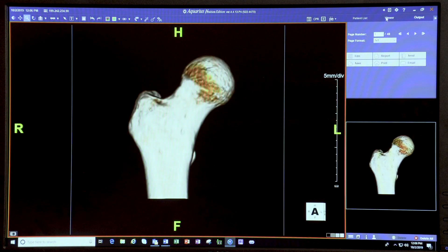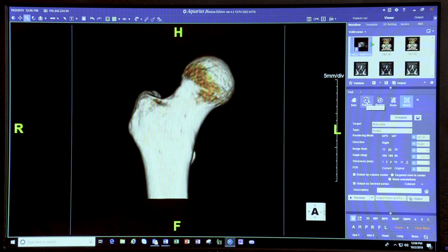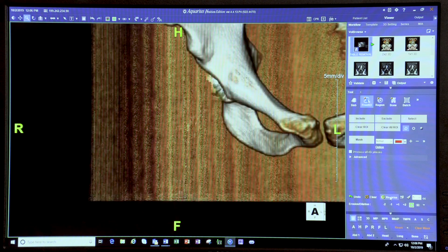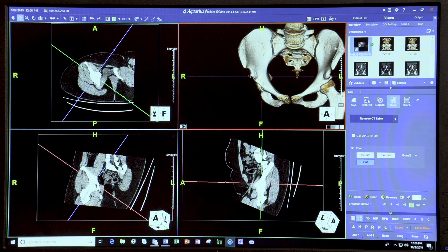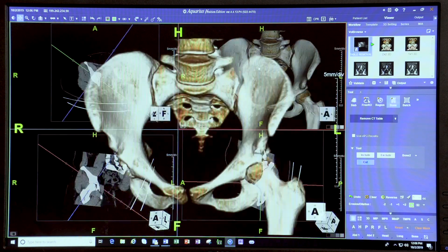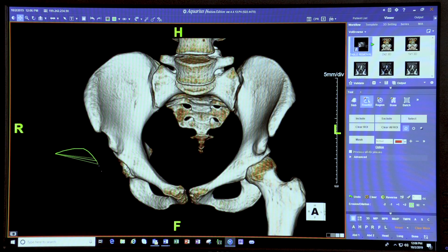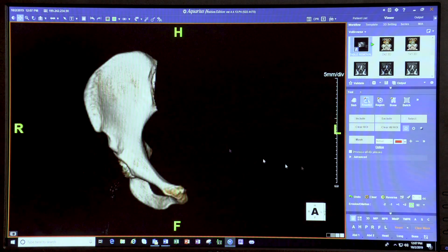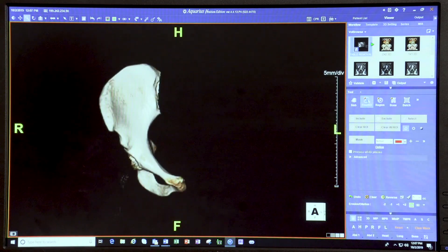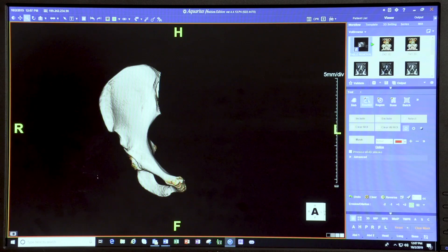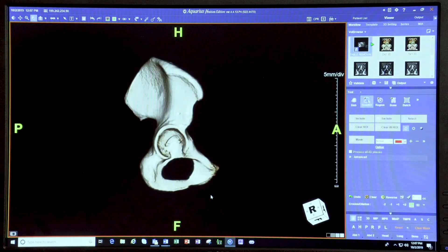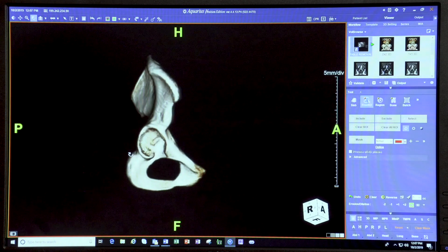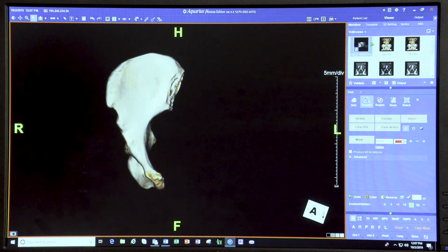Going back to the viewer, do Free ROI, Reverse, and now you have the acetabulum. Remove the table, bring it to center, use Free ROI to cut out any extraneous material, cut anywhere needed, and you have your acetabulum. Trim any remaining extra pieces, and the acetabulum is ready. You can then do the rotation and take pictures. That concludes our section on 3D segmentation.